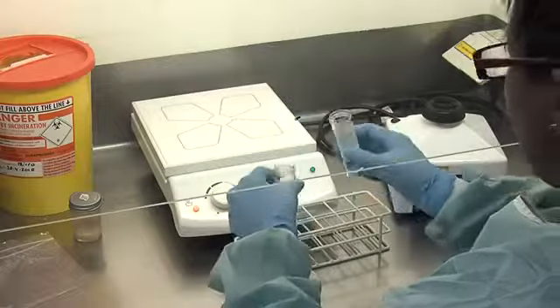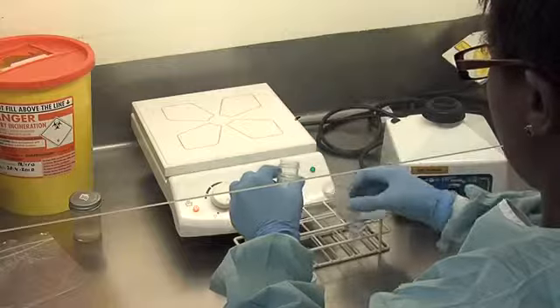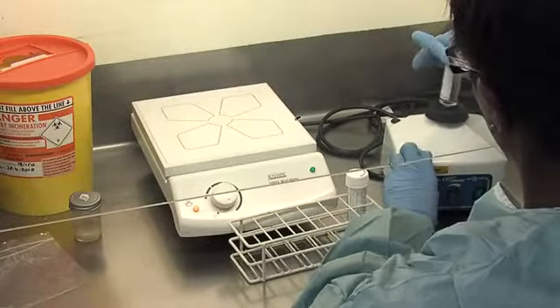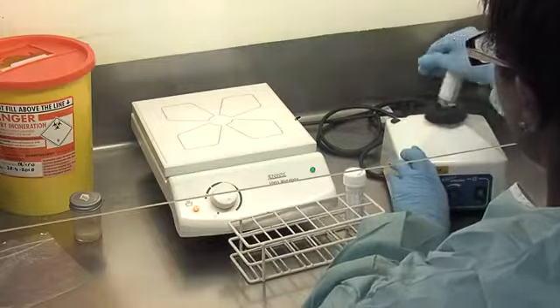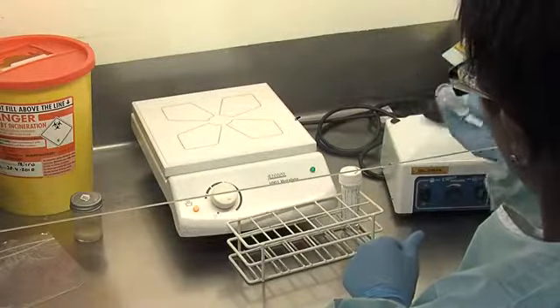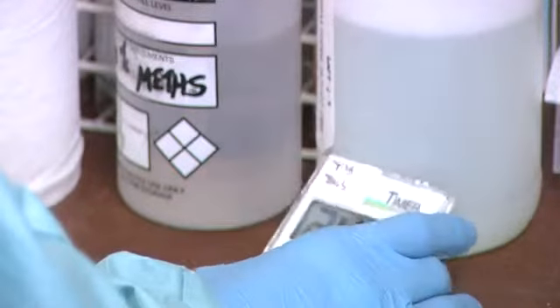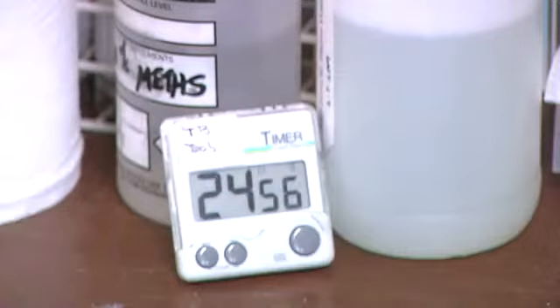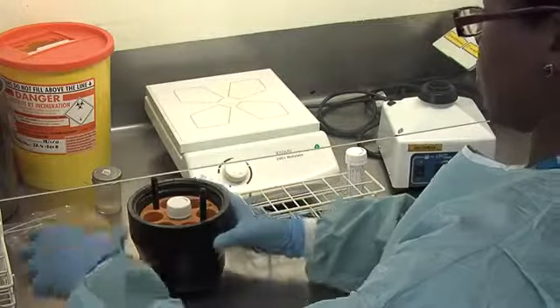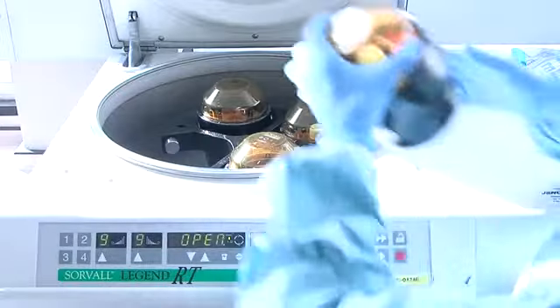An equal volume of sodium hydroxide is added to the sputum sample, mixed on a vortex mixer to emulsify, and then left to decontaminate for 25 minutes. After this time, the sputum and sodium hydroxide mixture is then centrifuged at 3000 G for 15 minutes.